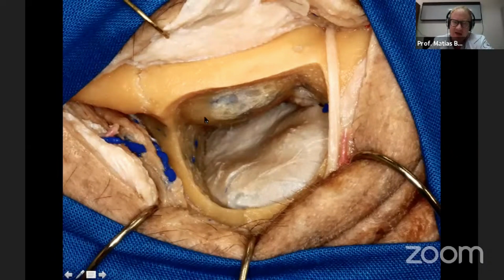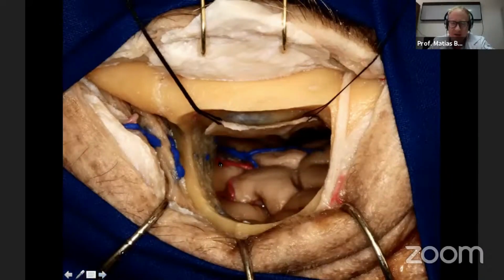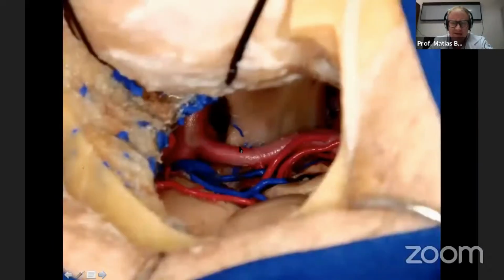foramen and the craniotomy, it's very important to remove the mammillary eminences of the roof of the orbit in order to create a straight angle of vision between the inferior frontal lobe and the roof of the orbit. It's very important to perform it. The dura mater is incised in a curved fashion with its base inferiorly. And we can see some structures.